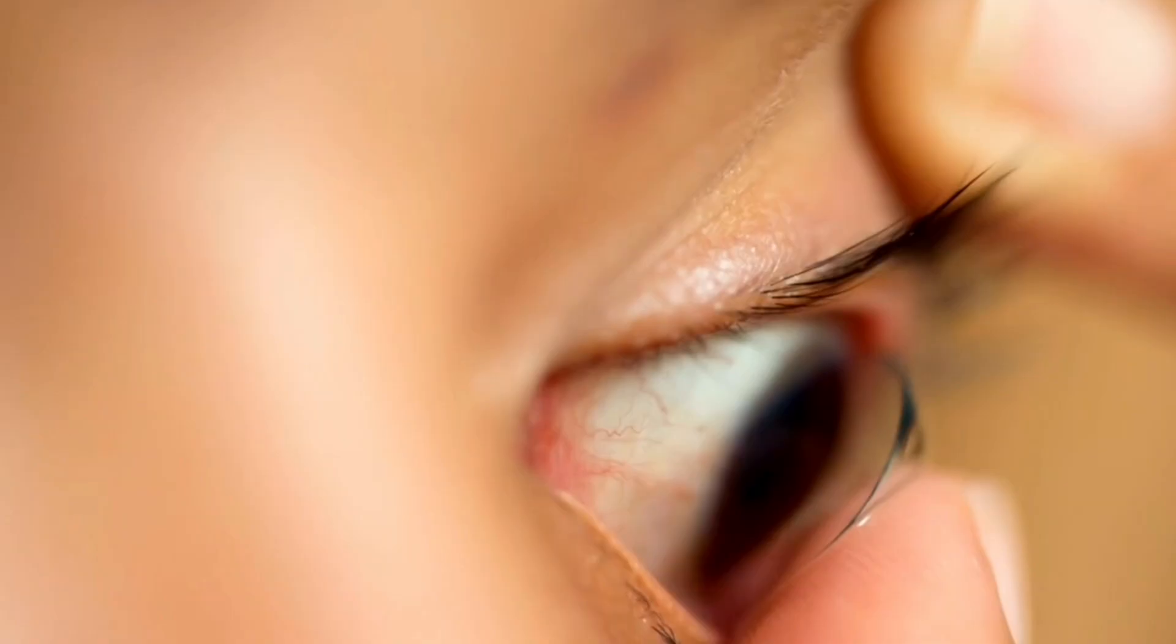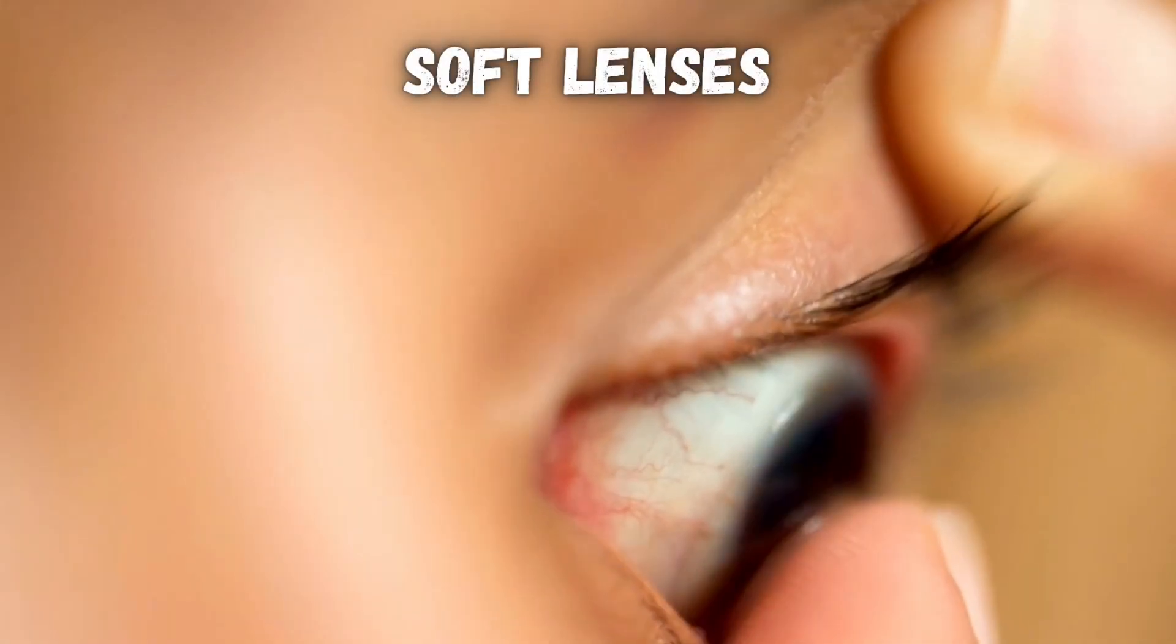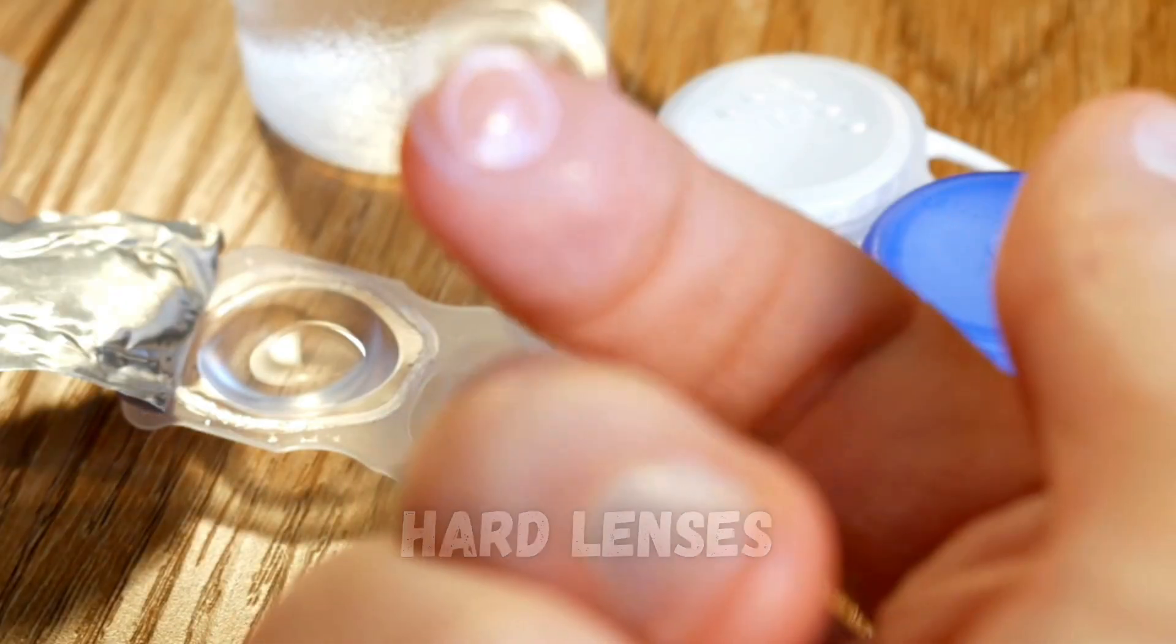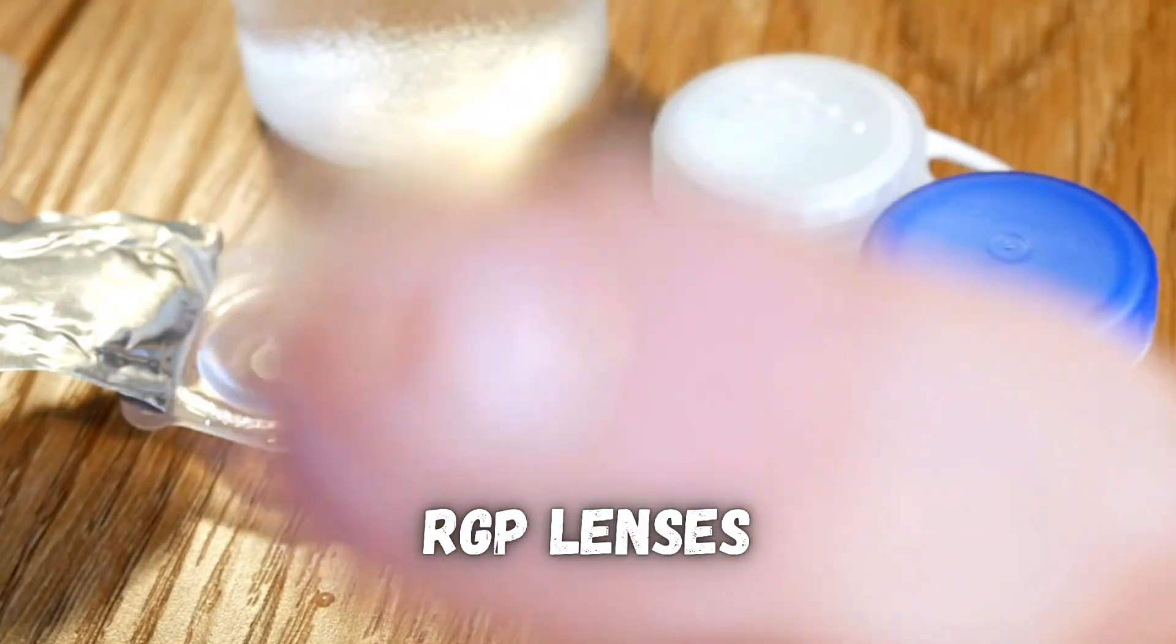There are two types of contacts: soft flexible lenses and hard lenses, also known as rigid gas permeable lenses.